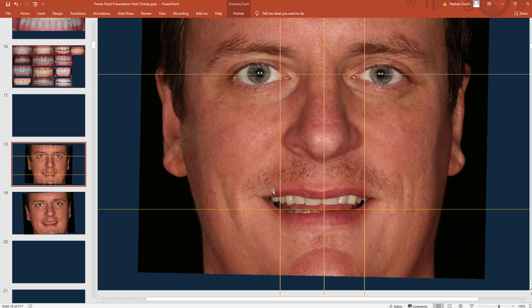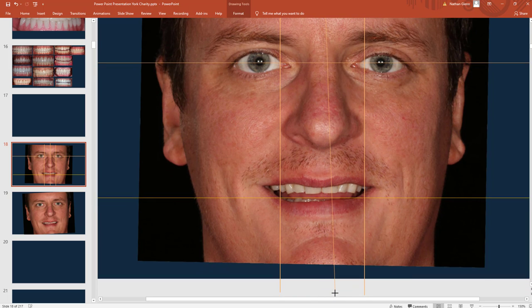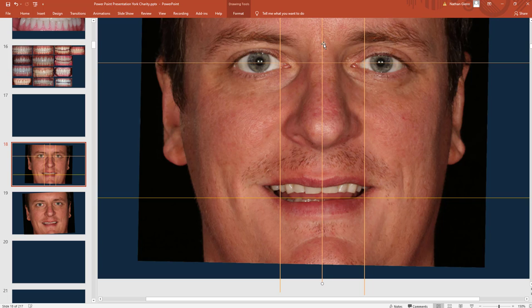Sometimes you'll have people with facial asymmetry — for example, a little more nose on one side than the other — and you can alter these lines if needed. For the midline of the face, I generally try to go right through the very middle of the bridge of their nose. For the lower component, I try not to use the chin and lower lip because those can get really asymmetric. What's been most reliable is to go through the middle of the nose or through the philtrum of the lip.